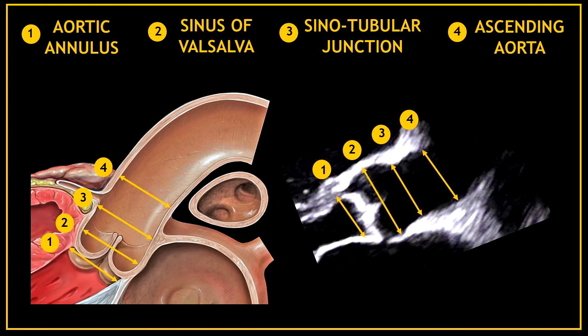Now let's have a proper look at all the segments you are able to visualize in the parasternal long axis view. In this view you are able to find and measure the aortic annulus, the sinus of Valsalva, the sinotubular junction, and the proximal ascending aorta.